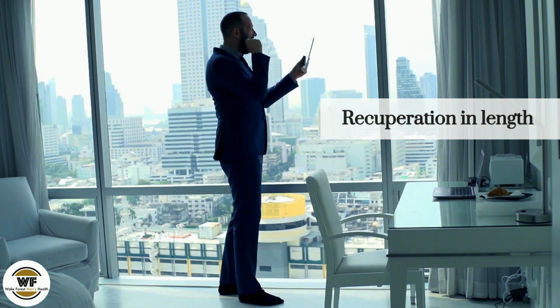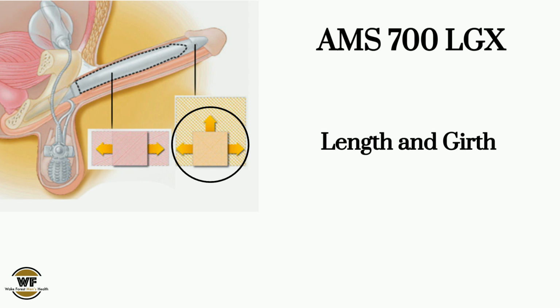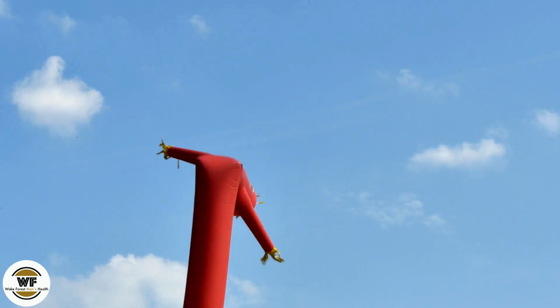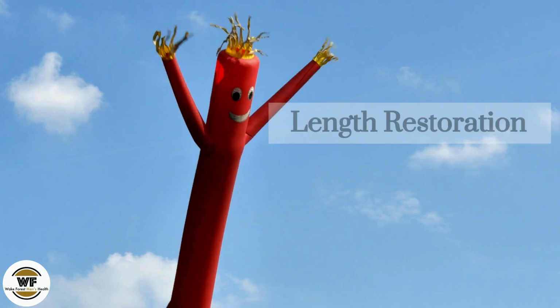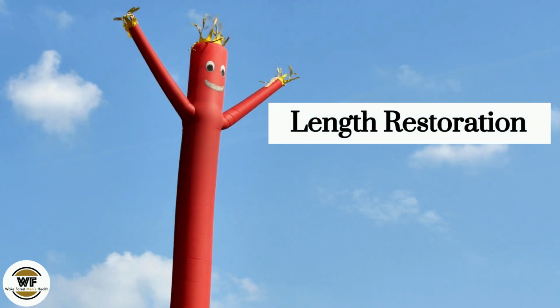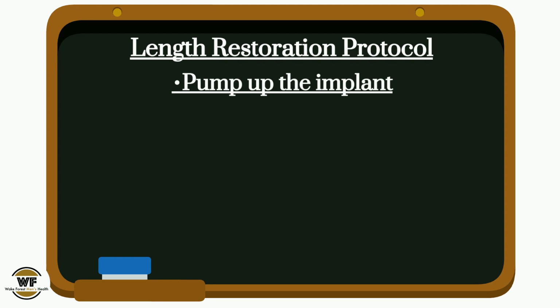The AMS 700 LGX, for example, can expand in length and girth if the tissue around it also expands to allow for this. Thus, to stretch this tissue, we encourage patients to follow a protocol aimed at length restoration. This involves the following. Pump up the implant until the pump feels firm, suggesting the cylinders are reasonably full.